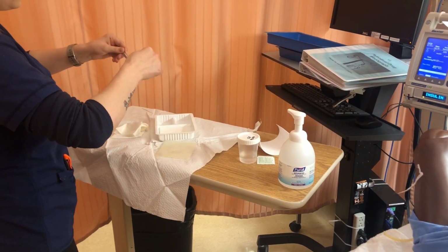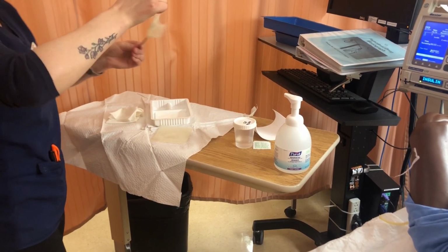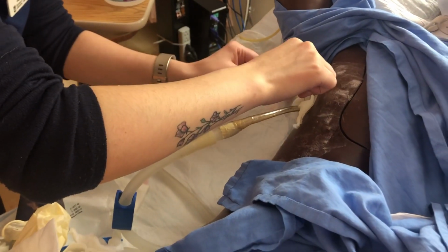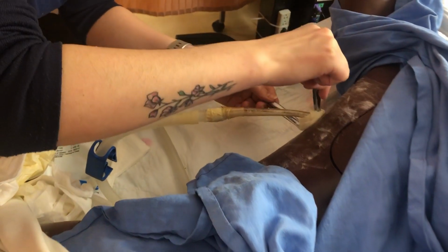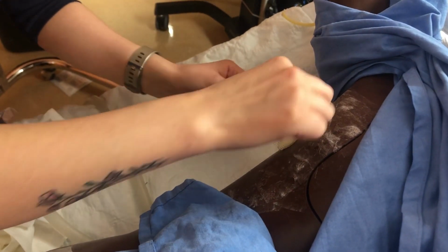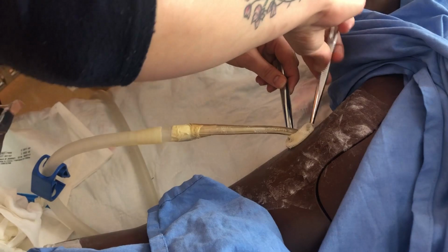Okay. So now I'm going to put this around the area, making sure to make it occlusive, kind of in a donut shape. So, okay, I'm happy with that.